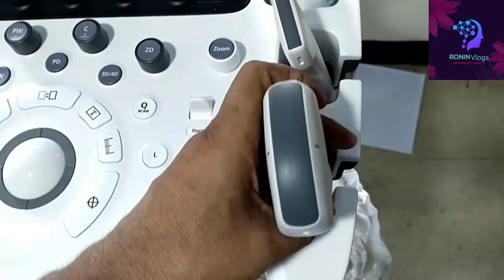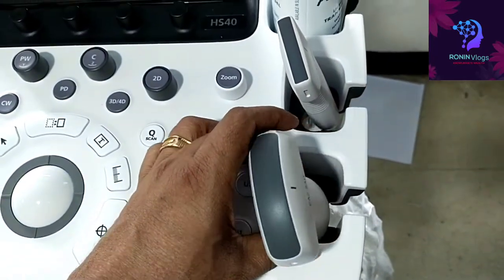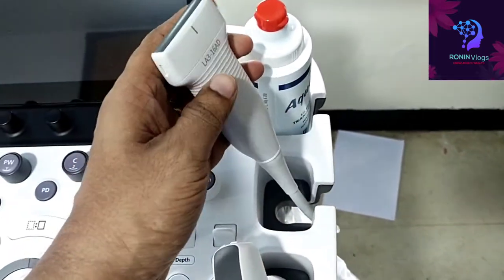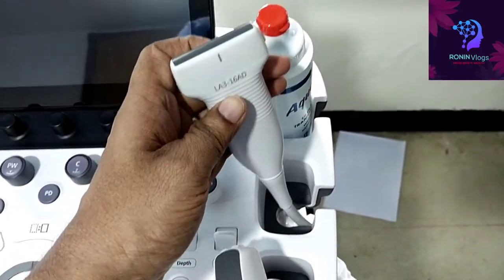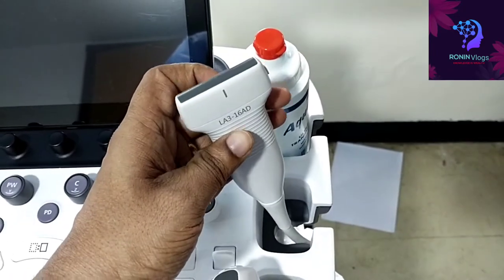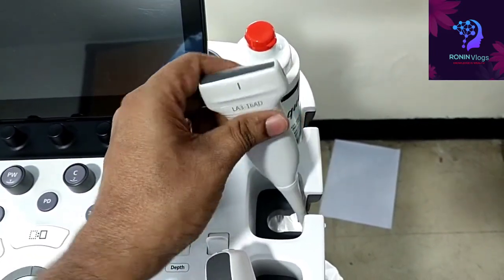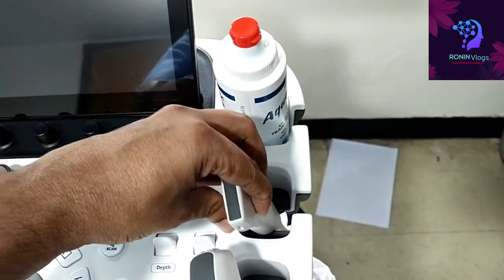Actually this machine can have four probes. Four probes we can attach. This is the linear probe.